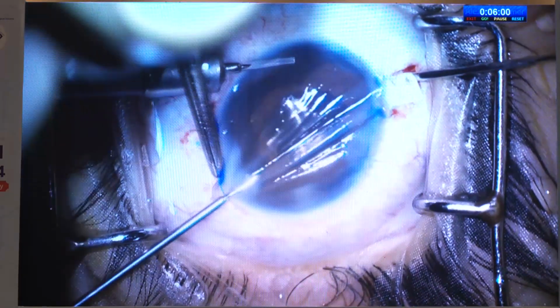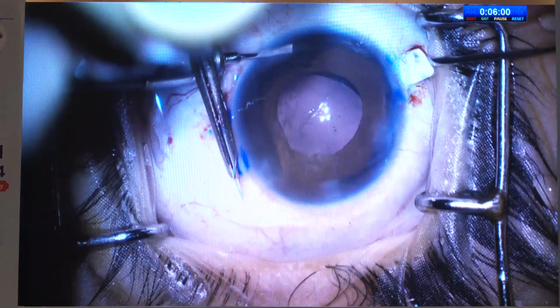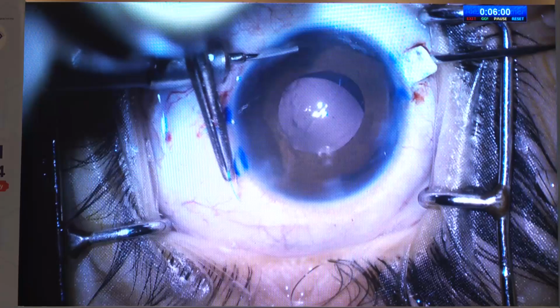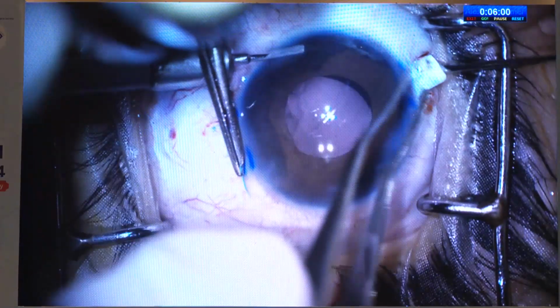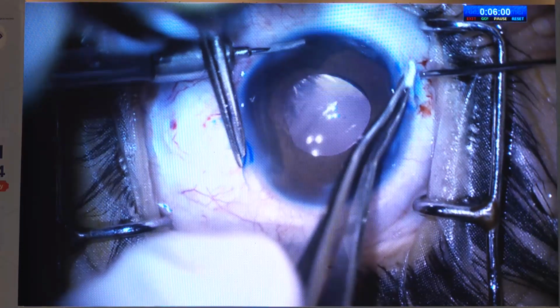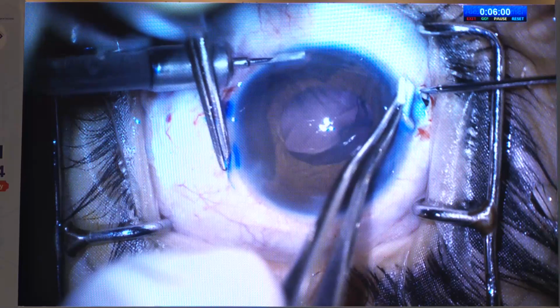Thus on both sides, through the iris, the haptics were exteriorized along the vertical meridian of the eye, in contrary to the horizontal meridian. It was done because this was a case of megalocornea in which SFIL was previously done and the IOL had decentered.